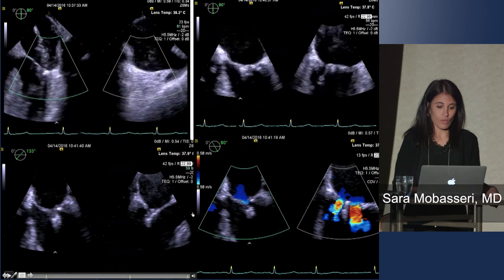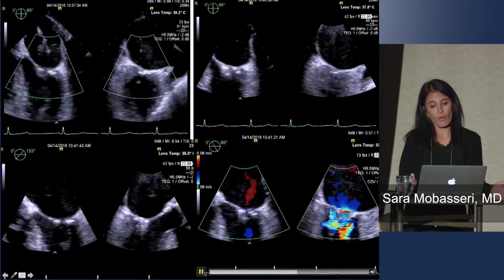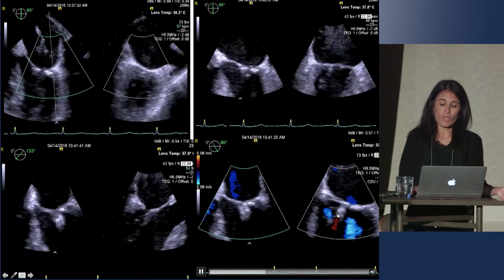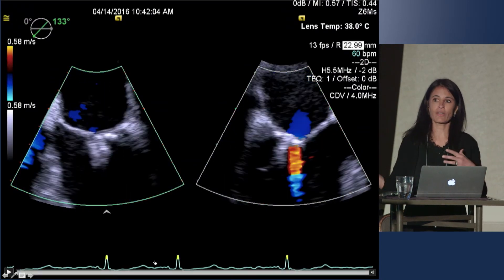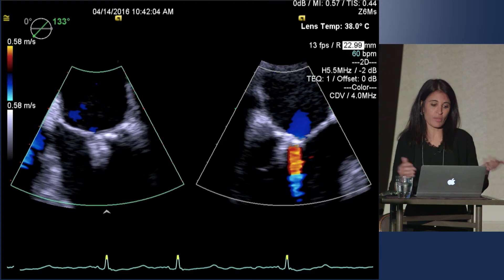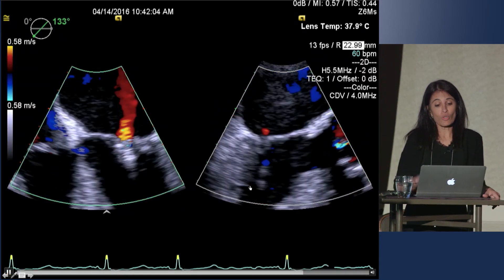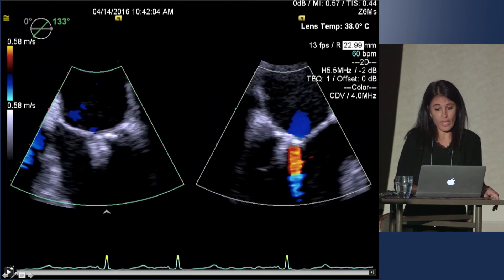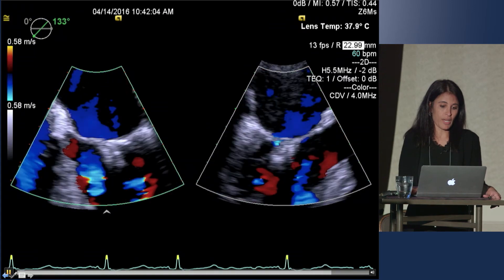Here we are with a question of how much MR do we have. You have multiple jets — this is a commissural view. In the lab when you're talking to one another, you try to have the same language between the implanters and the imagers, and sometimes you're not always on the same page. We're saying one plus, two plus — this is more of a qualitative assessment and it really doesn't look that bad, but we still want to look at some other measurements.